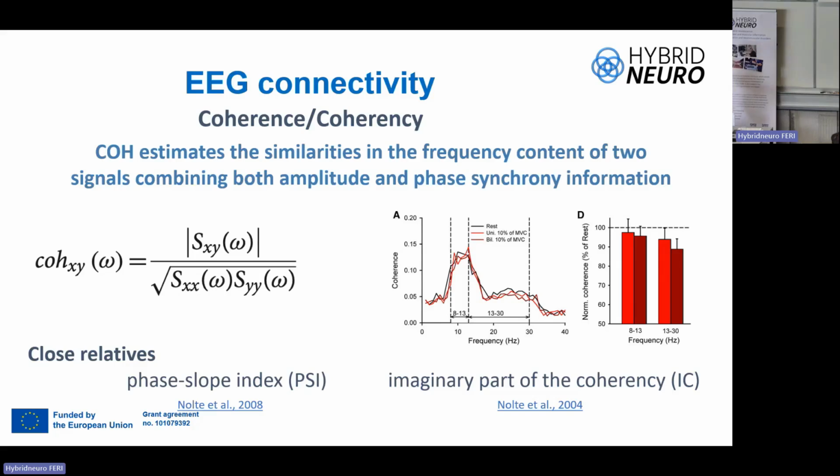It helps to be sure that when you relate two EEG channels, the dependency is because there is a transmission or a relationship between these two areas, not because they come from a specific source inside, which is propagated and reaches these two electrodes.